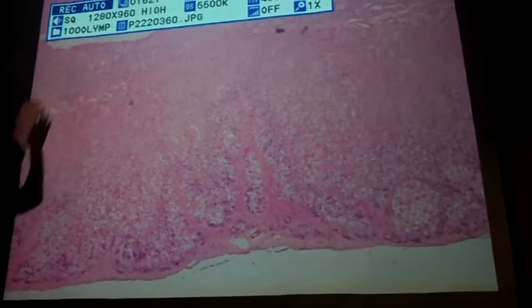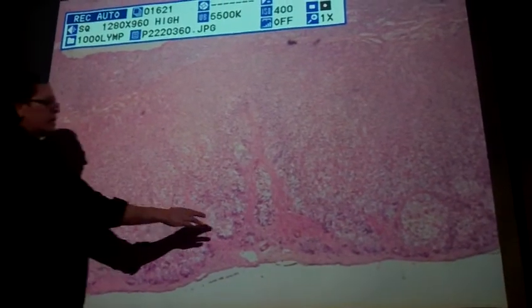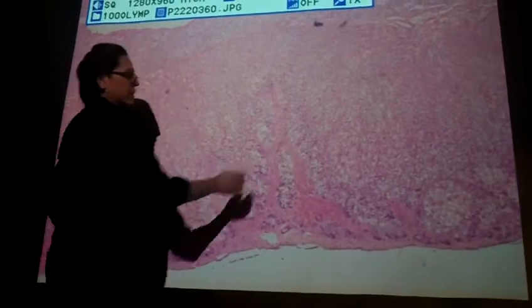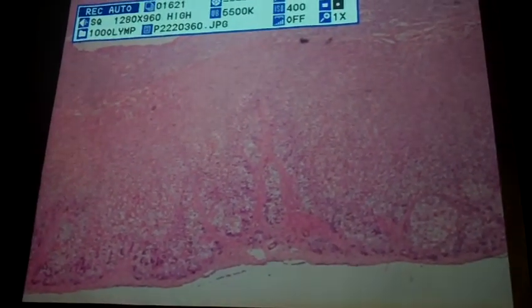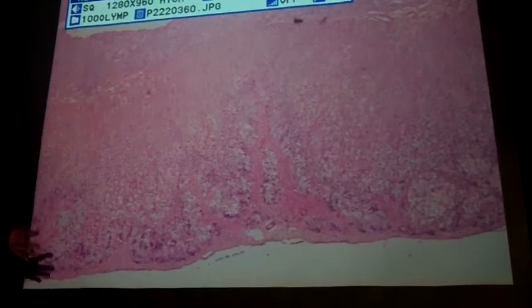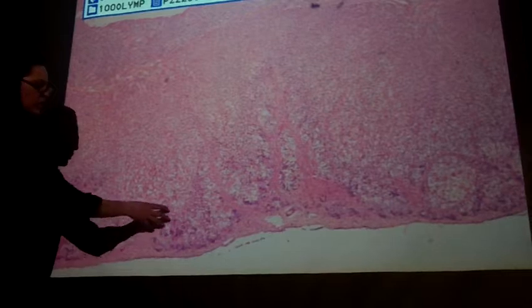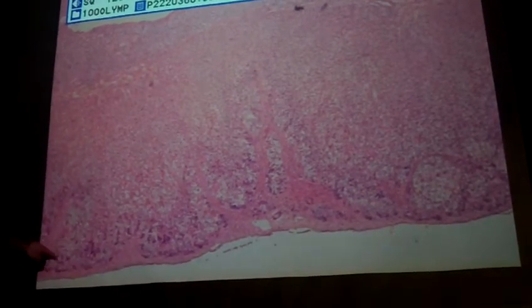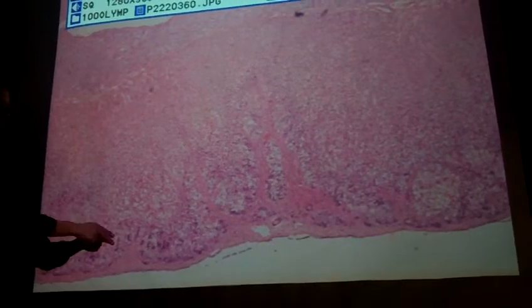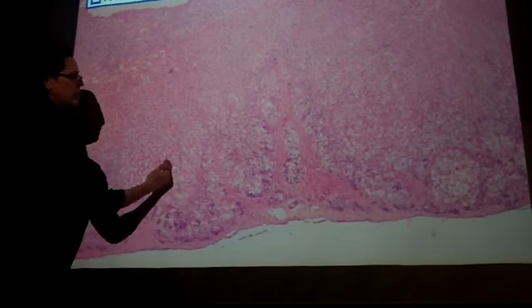What's the area that's kind of jutting inward, like that weird pink thing? This right here? Yeah. It's probably just the tissue folded when they were staining it, so it looks a little bit darker. But you should be able to see that glomerulosa looks a little bit darker, and that's because the cells are kind of clumped together, oriented like this. So they're close together.